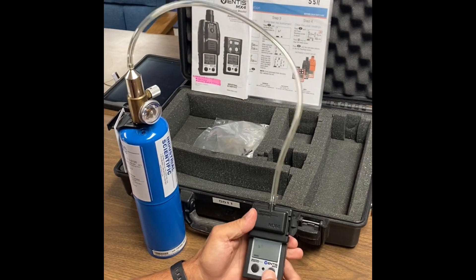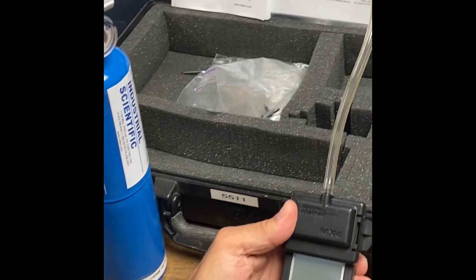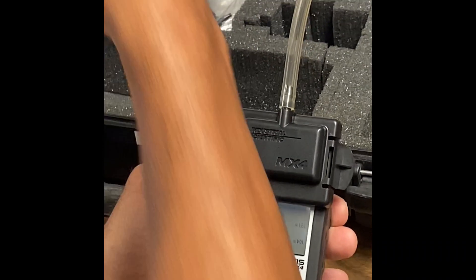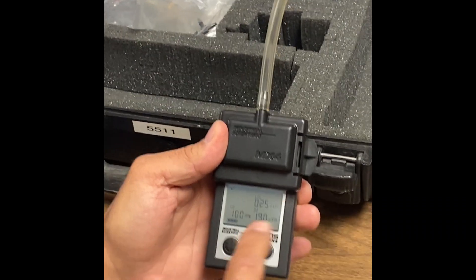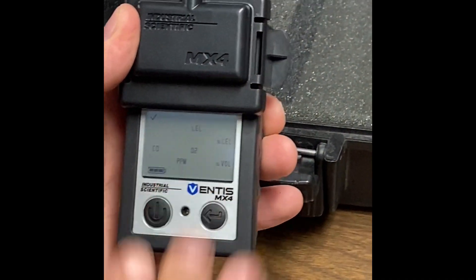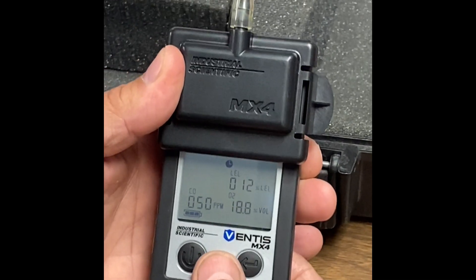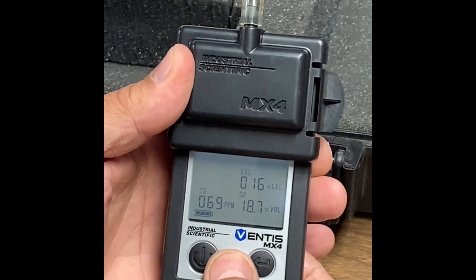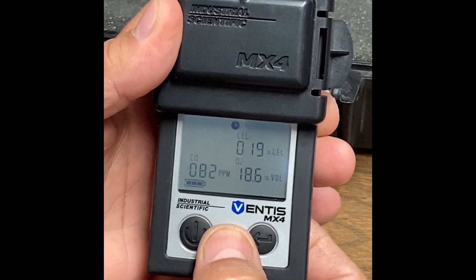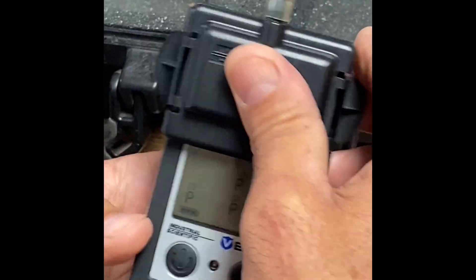Press the enter button, and then turn your gas on. You're going to see these three sensors flashing right here. All this is doing is making sure that the sensors are actually working properly. Put your finger over to keep it down. Within a couple seconds, you're going to see three P's — one, two, three. That means you're complete.